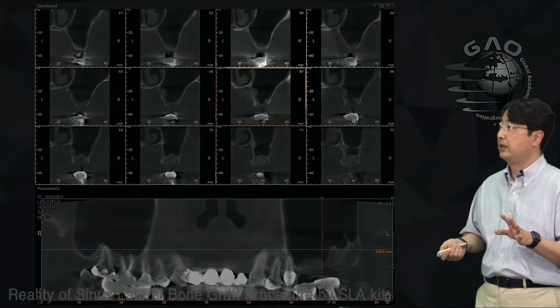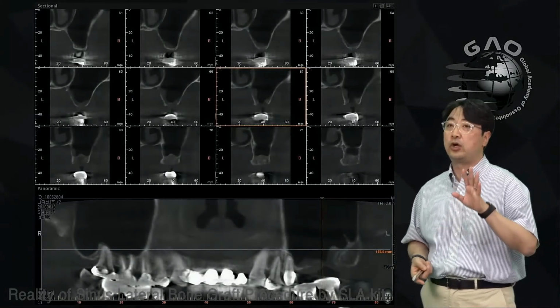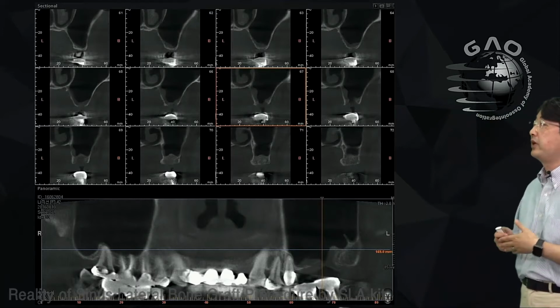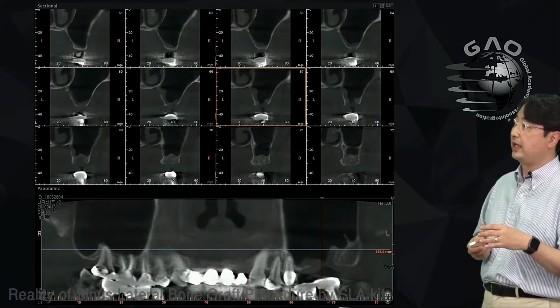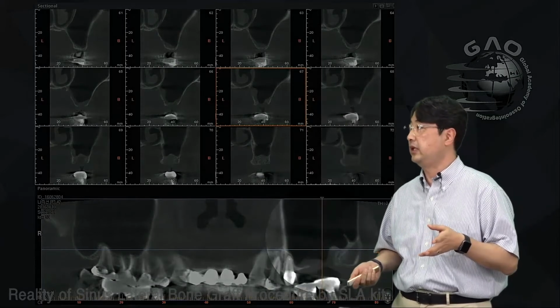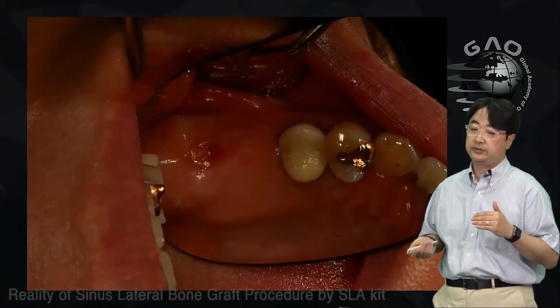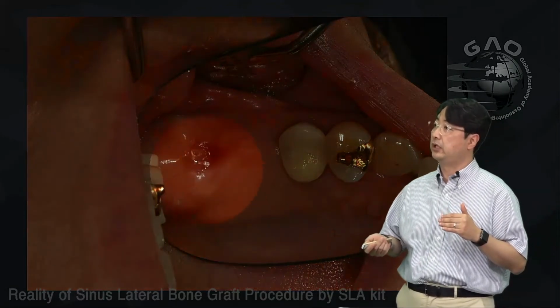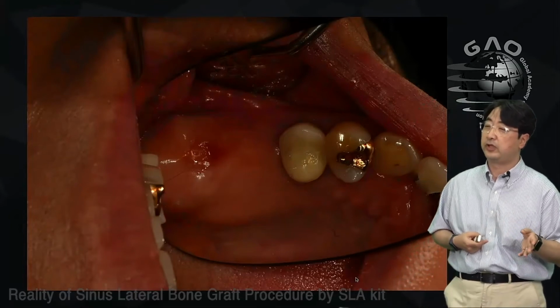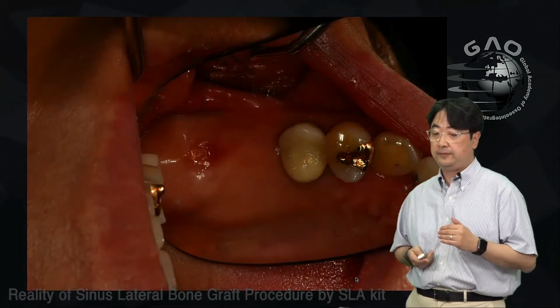As you see, there is no membrane thickening anymore, right? But still, the problem is here you can see the opening of the crestal part, right? This membrane thickening, I think, is from an odontogenic origin, right? So here you can see the opening in the crestal area. This is the clinical picture. As you see, the redness on the crestal area, maybe around the number 27 area, right?